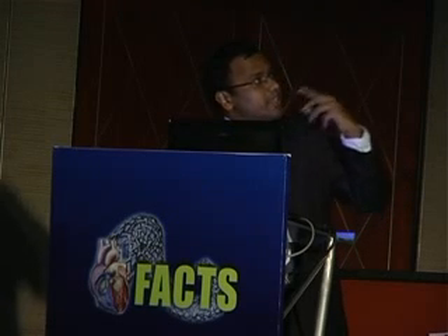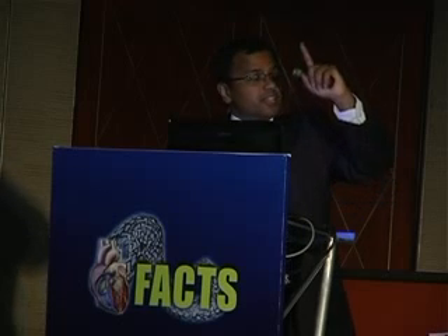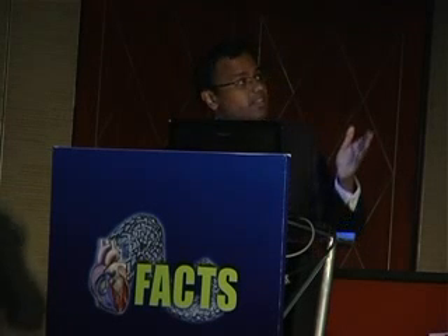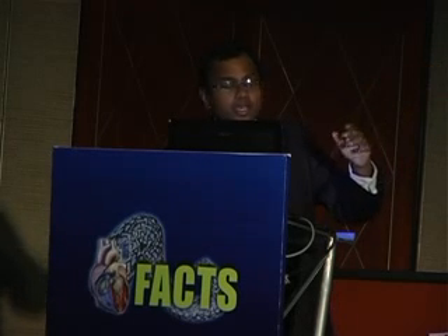Usual dissection — this is the size of the incision which I normally do for our minimal access cardiac surgeries as well. What you see now is the pericardial fat. You move the pericardial fat to the side; the lung can come into view sometimes, and by placing a wet swab you can just move it away.